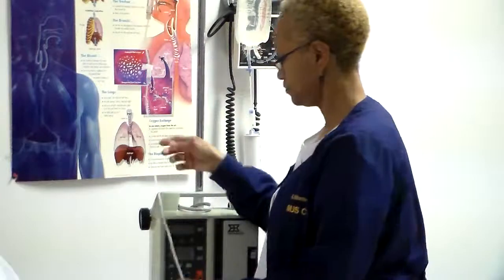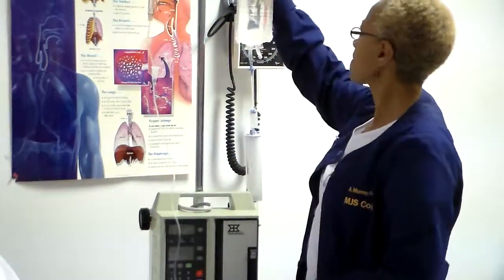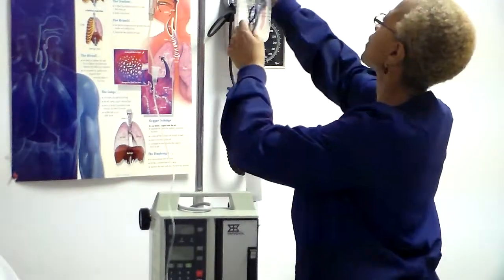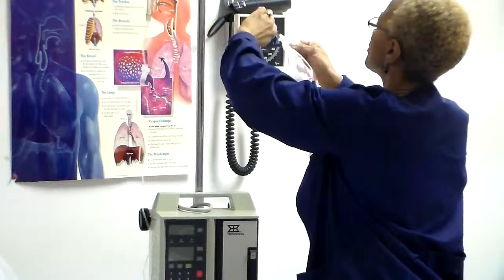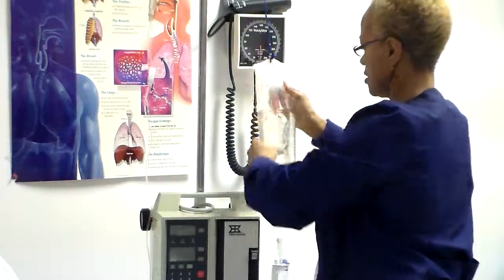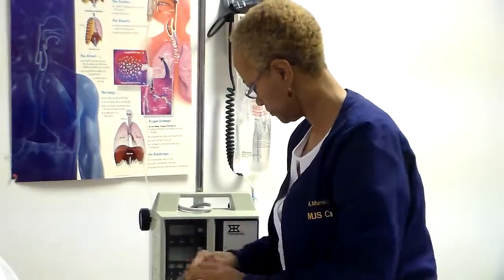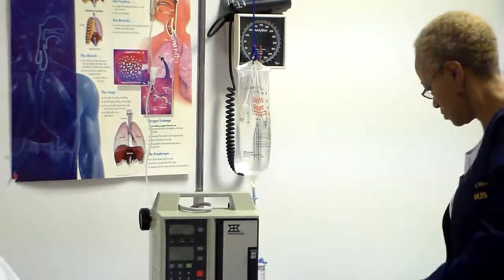Hang piggyback medication bag above level of primary fluid bag. Use hook to lower main bag. So you're going to take your primary set and lower it so that your secondary set will administer first. Hang tandem infusion at same level as primary fluid bag.